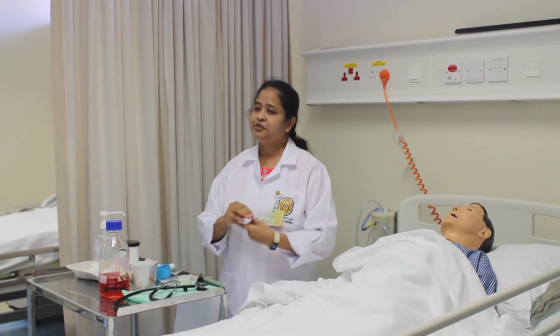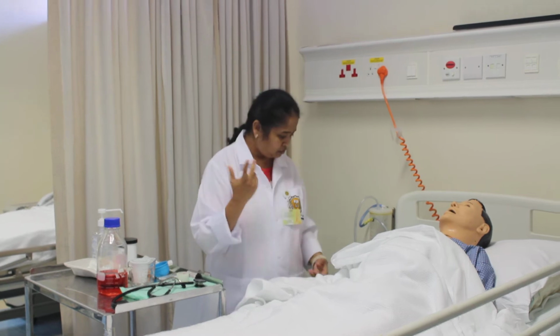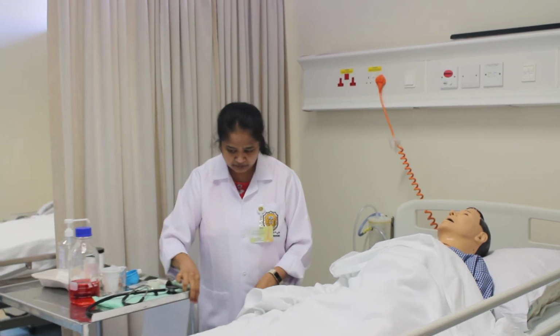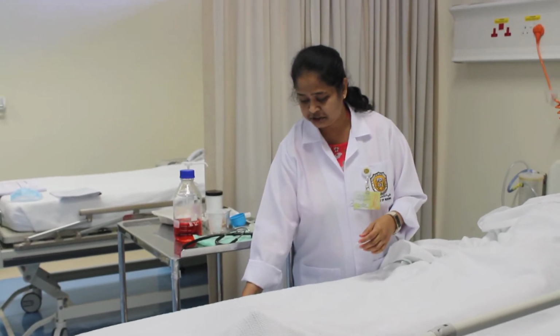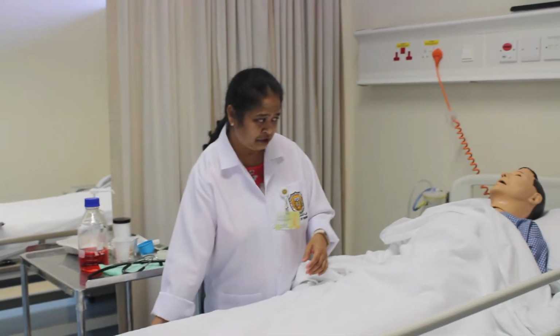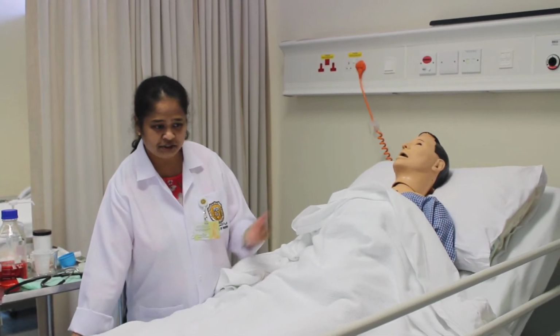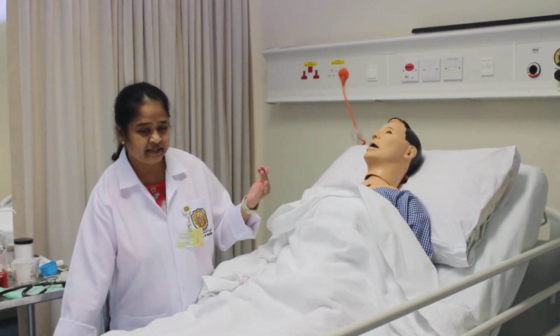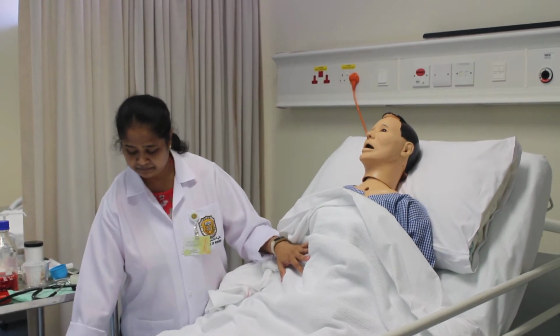Okay, first of all you should remember that we are going to position the patient. There are two positions which you should keep in mind. First I will be putting the patient in high Fowler's position. You know what high Fowler's position is? It is raising the head end of the patient as much as possible. It's almost like sitting. So if the patient is conscious, we can even make them sit.